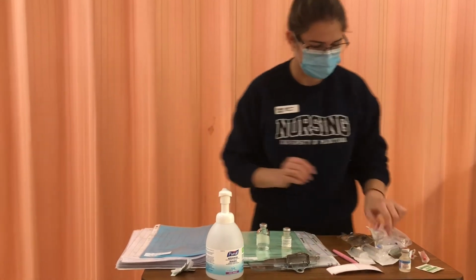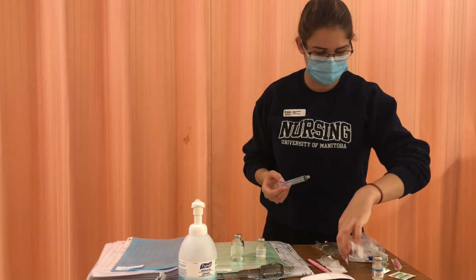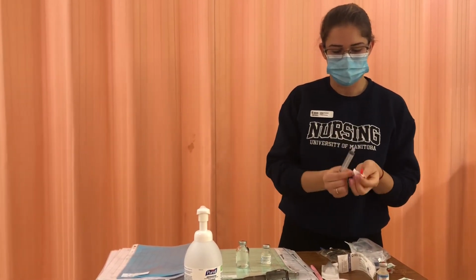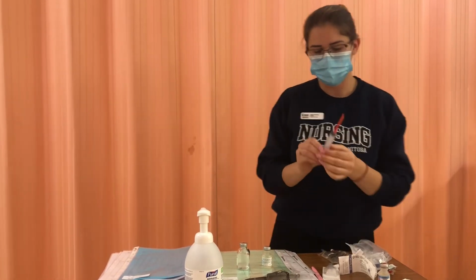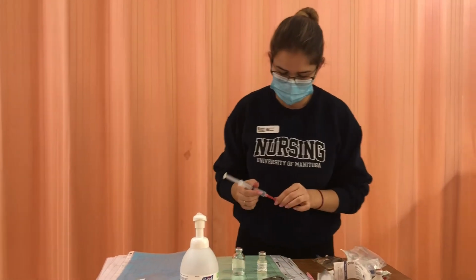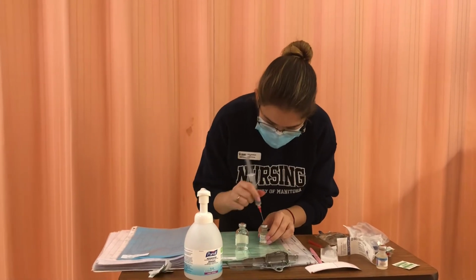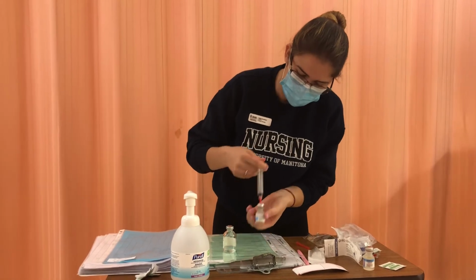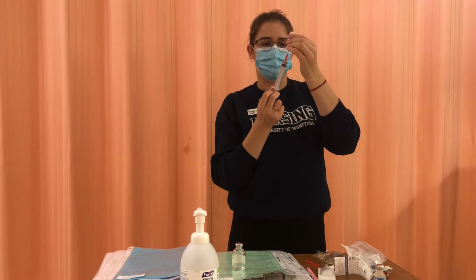I'm going to choose my 10 mL syringe to draw up my 6.8 mLs of sterile water, just because that's the most appropriate syringe to pull out that dose. I'm going to pull out 6.8 mLs of air to insert into my sterile water vial. Okay, so it's clean already, we're good to insert it. There's my air. And I'm just going to pull out 6.8 mLs of water.